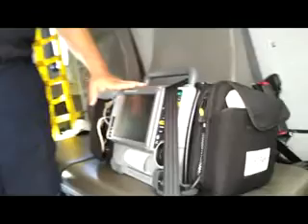Well, these monitors here, we have one of these in all of our units. We can do 12 lead capability. We can defibrillate, and it also works as an AED, just like you see at the Walmart or wherever. All that's built into here.